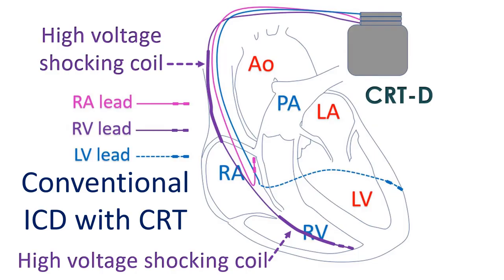Another disadvantage is that it cannot be combined with a cardiac resynchronization therapy (CRT), which is also known as heart failure device. CRT paces both lower chambers and one upper chamber of the heart in selected cases of heart failure.